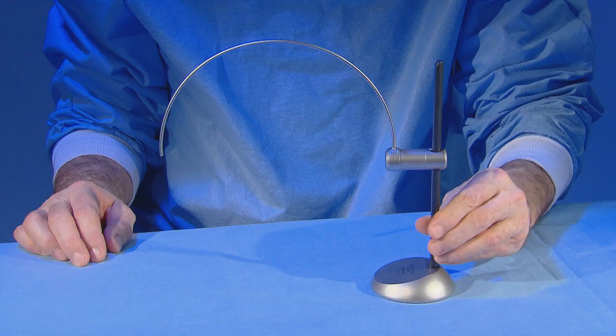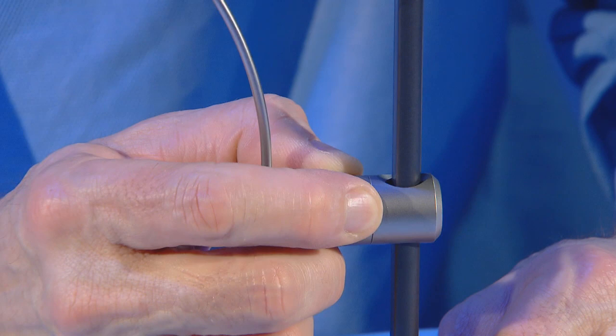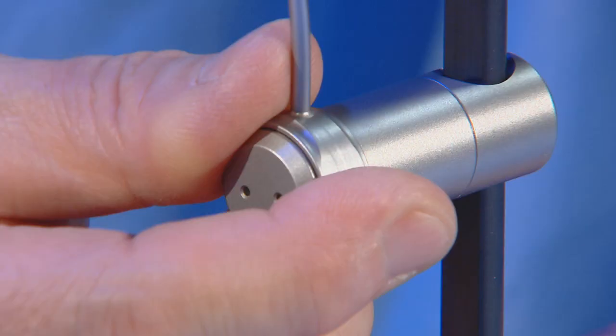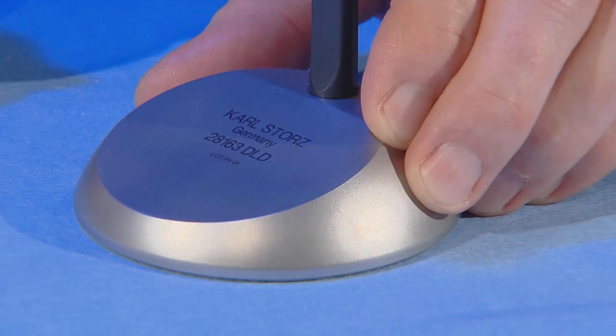The system also includes a special localization device that consists of a stand and an arch fixed to the stand. This stand and arch can be moved in several directions, which allows both arms of the arch to be perfectly aligned with the target disc.